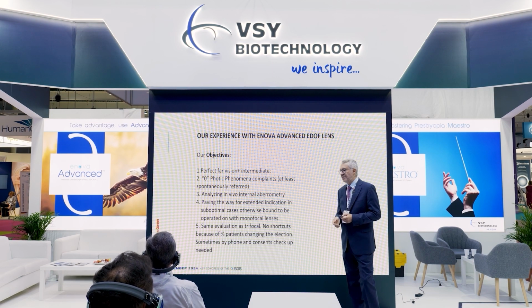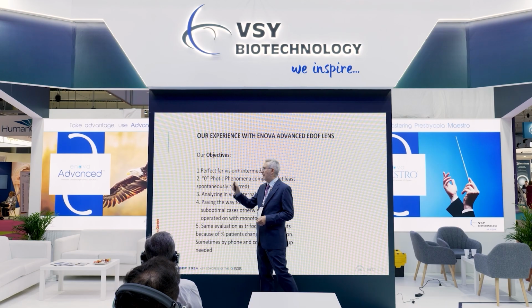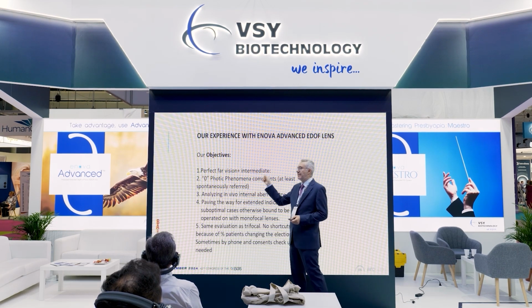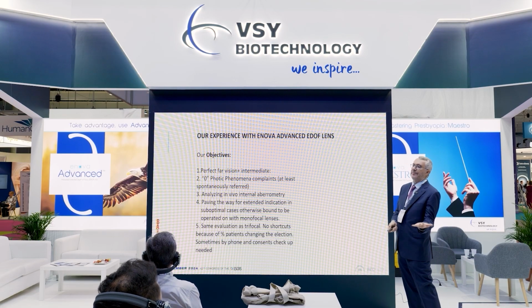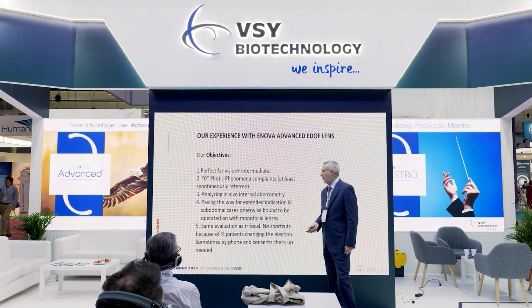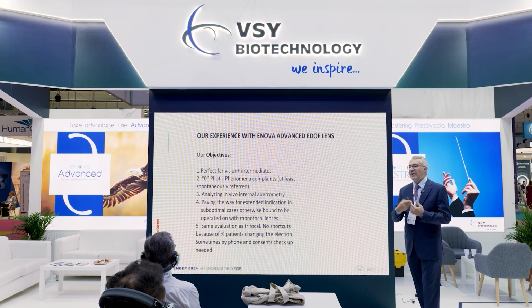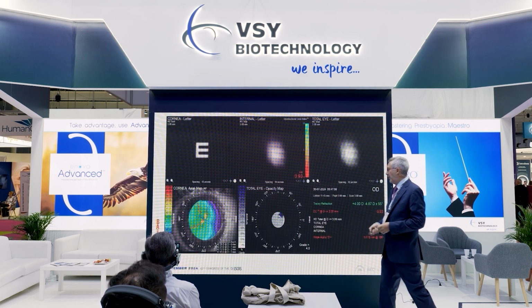Here we are going to see the first 9 cases, where our objectives initially were mainly having a perfect far vision with the absence of photic phenomena, and having some extent of intermediate, and I would even say we were aspiring to having mobile phone vision at 60 centimeters. We are analyzing in vivo, and we are now paving the way, having gained confidence in the average cases, to a further extent to former indications of monofocal that we are going to show you.